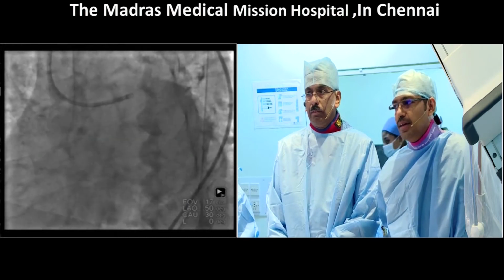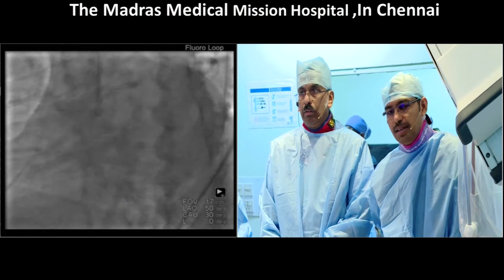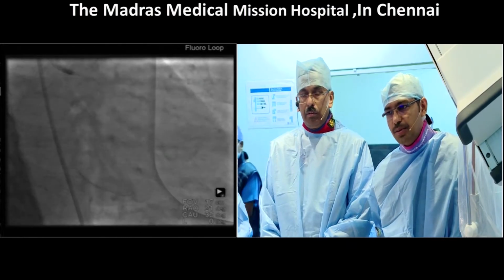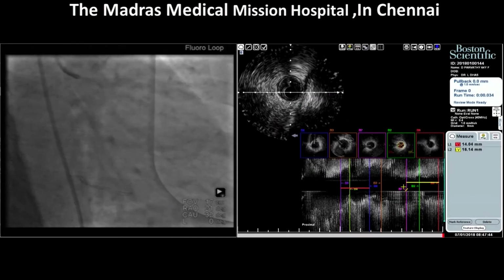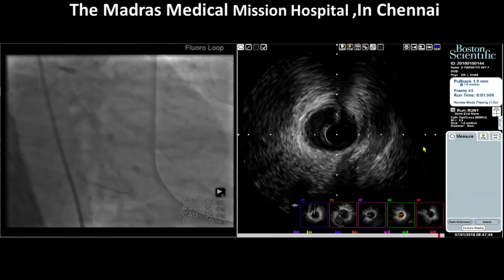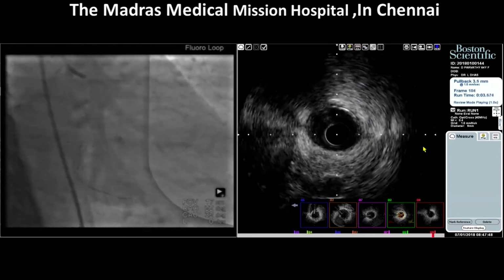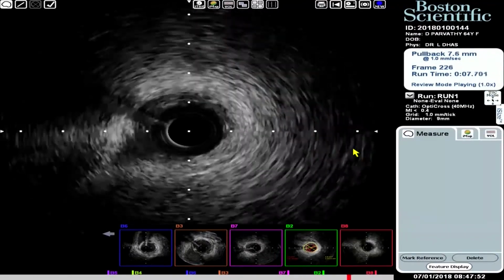And so can we show the intravascular images, please? So it should be a straightforward lesion, two lesions and two small short stents here. So any comment? Angiographically, we could not see any calcium here. Can we have the live IVUS pictures? This is just to show how to do an IVUS-guided stenting.